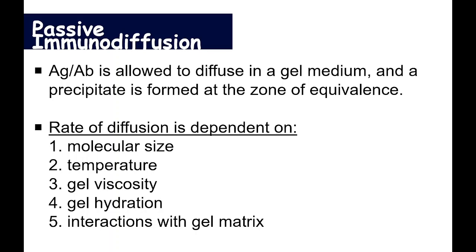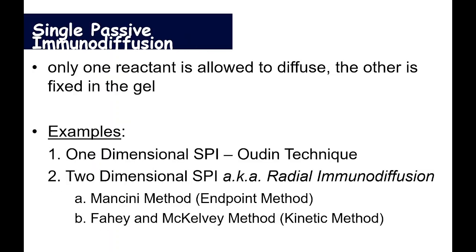So in that case, we need to use another type of medium to facilitate the movement of the molecules inside the gel.